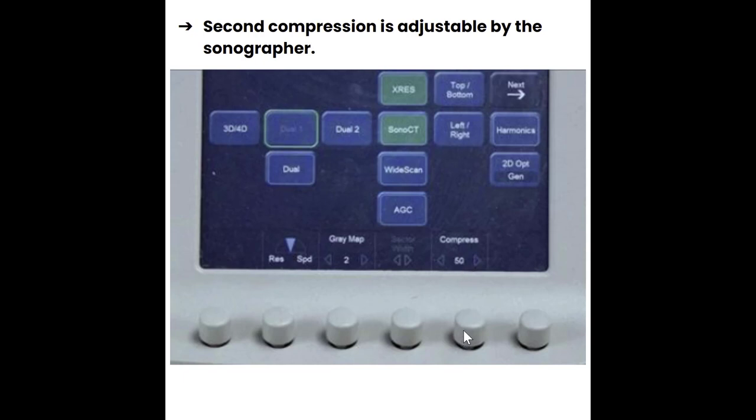Earlier I had mentioned the power being buried into things. This might be where you have to hit the next button here, and you might finally find power being associated with one of these knobs. So it's just a matter of finding where your knobs are, and it's a big part of the whole knobology piece of becoming a sonographer.